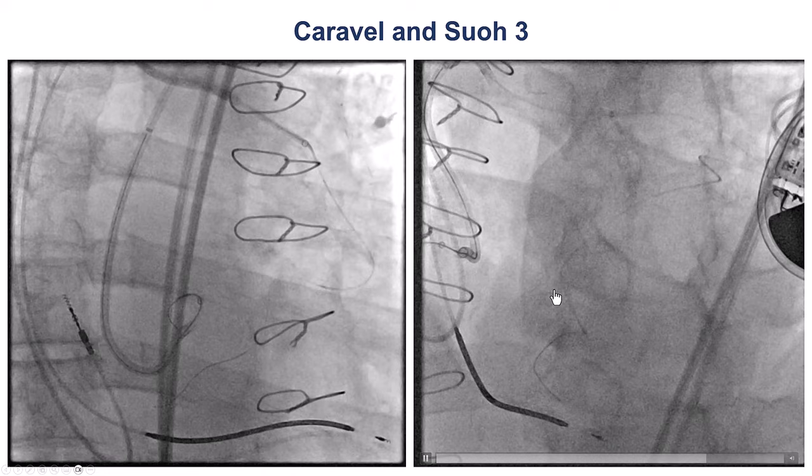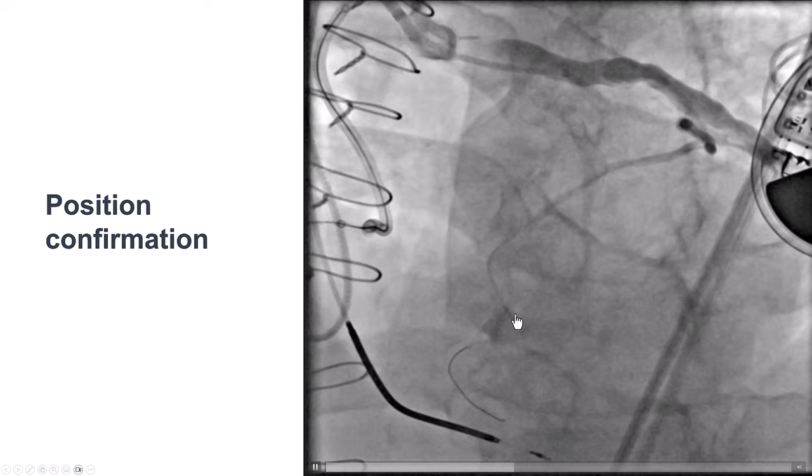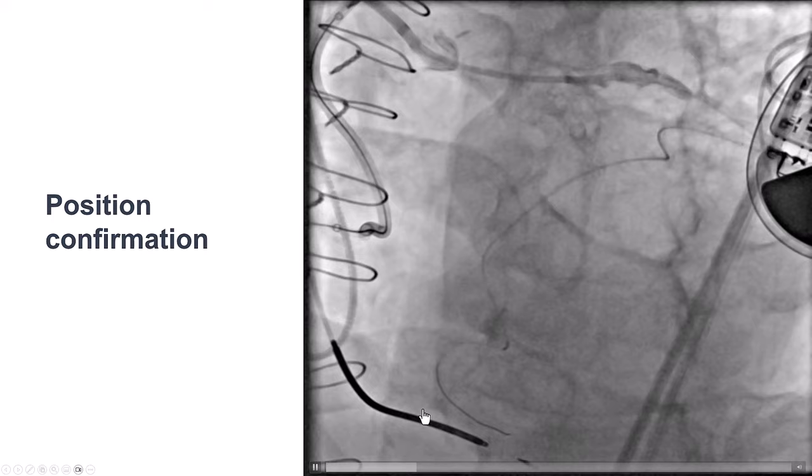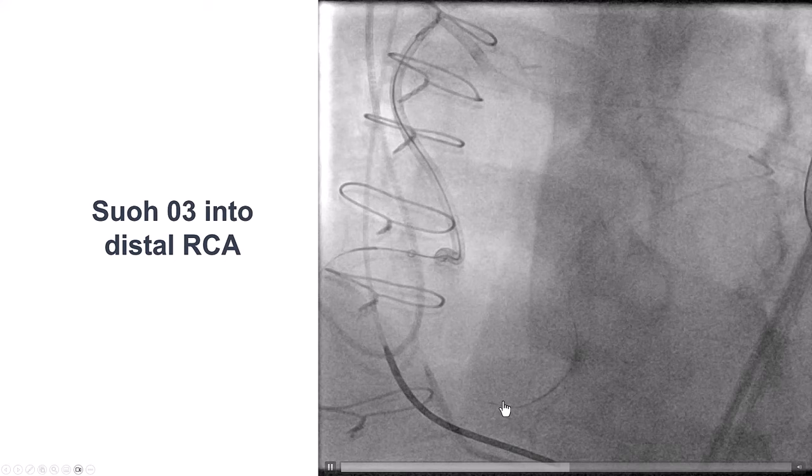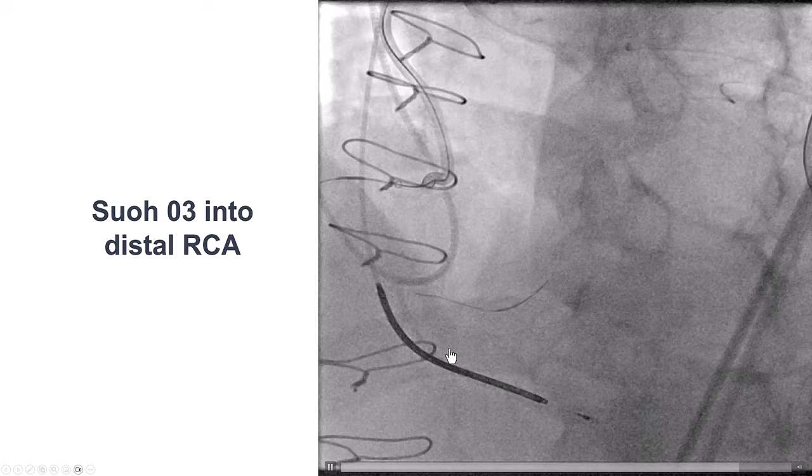By doing an injection, we were able to visualize the distal vessel. We are indeed into the right posterolateral, coming to the PDA. We then tried to advance the SUO-03 into the distal right coronary artery, and we were able to make some progress.